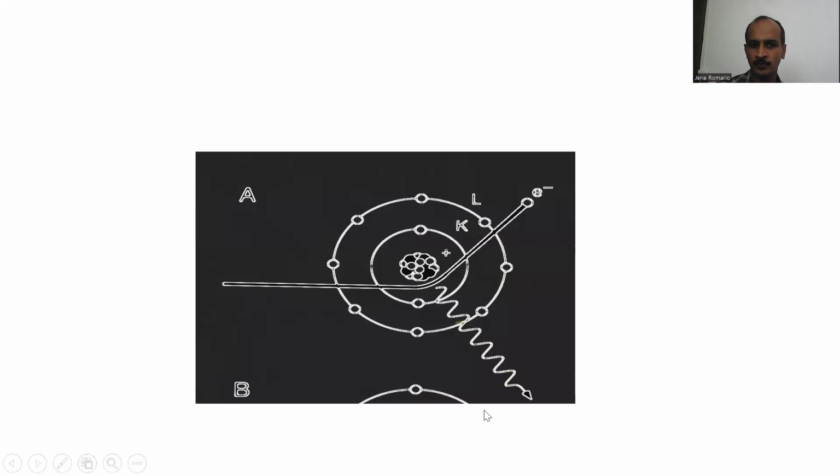This picture explains what happens. The electron comes and goes very near, and it changes path, and a very low energy electron comes out. But when the speed is reduced, a lot of heat and X-rays are produced.